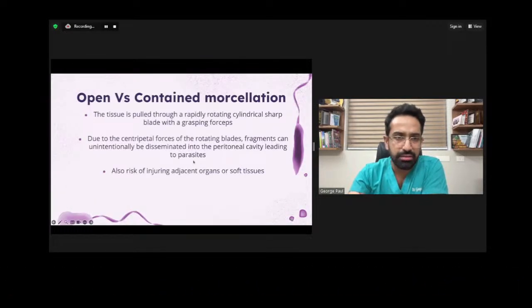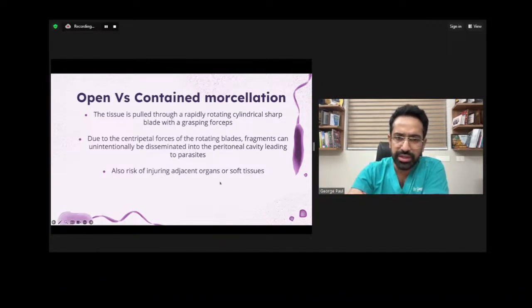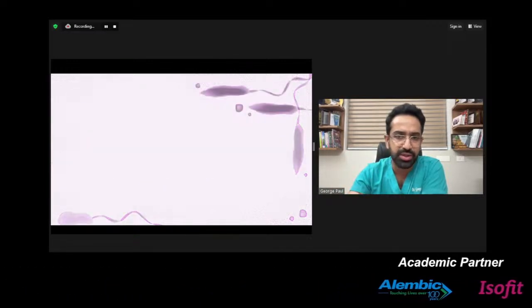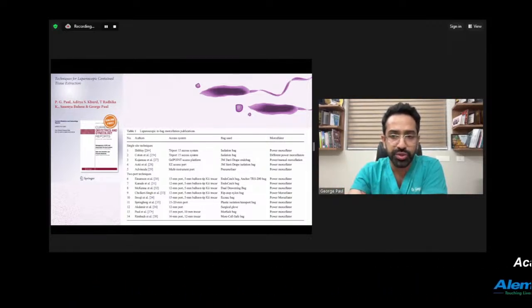So comparing open and contained, I think it was pretty much evident with the videos. Using a bag, another advantage is that you prevent any risk of injury to the adjacent organs and soft tissues. We had done a review of literature of the various methods of tissue retrieval.